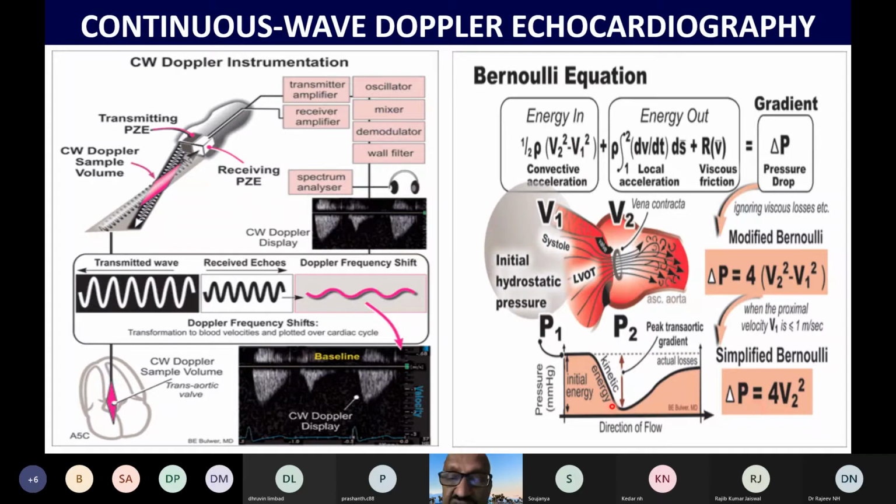Here it's also necessary for us to know that, especially when we talk about the aortic valve, as the blood passes through this narrowed orifice, there will be negative pressure generated here and the pressure becomes recovered somewhere across the aorta. That is called the pressure recovery phenomenon.